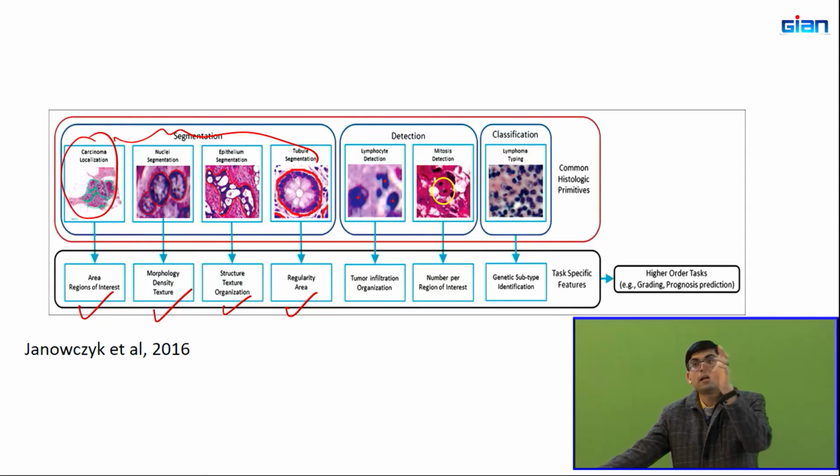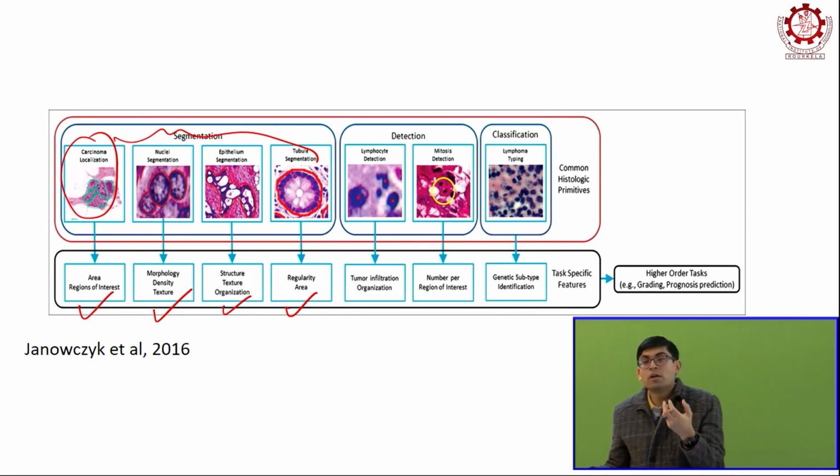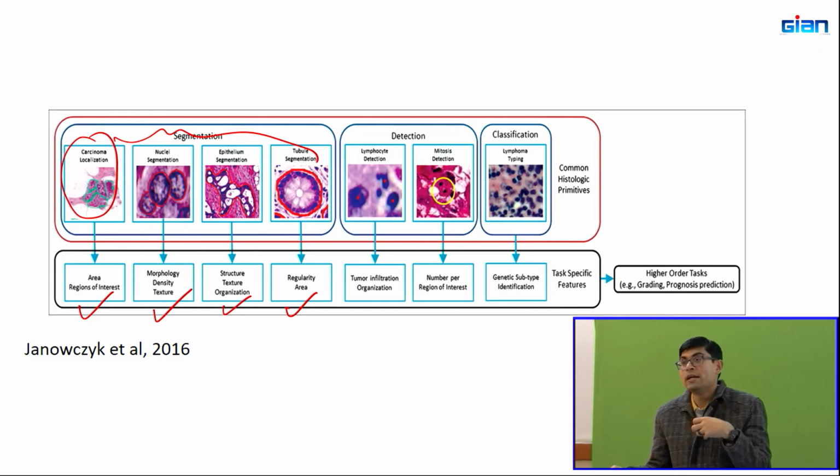So these are huge images, and imagine a pathologist having to traverse, navigate that entire whole slide image just to find one mitosis. Now, if you can have an AI model that can, let's say, quickly go through the image and figure out where these mitosis regions are, that can essentially help reduce the time that it takes for a pathologist to study that image.